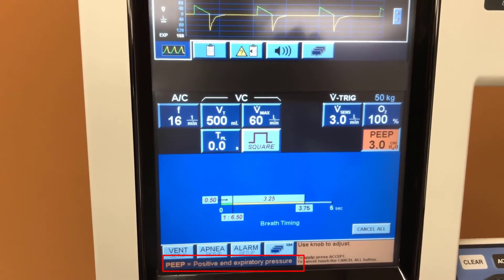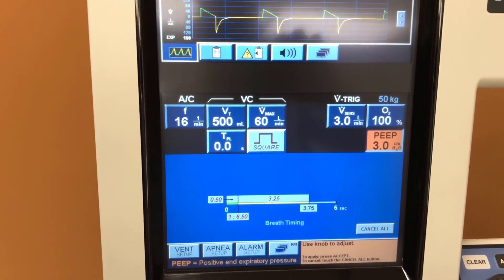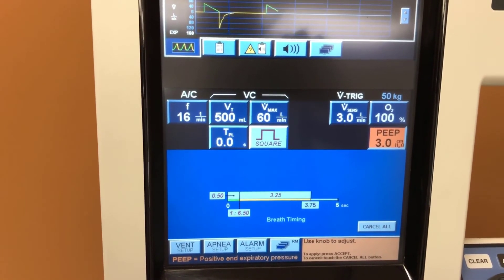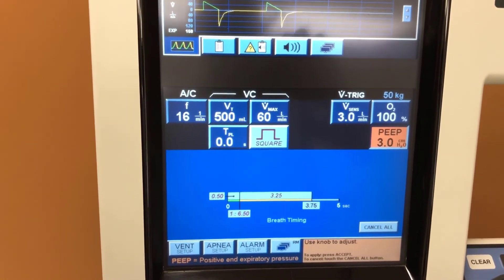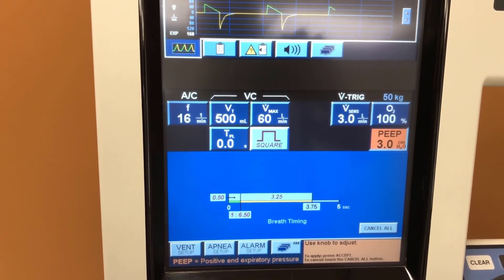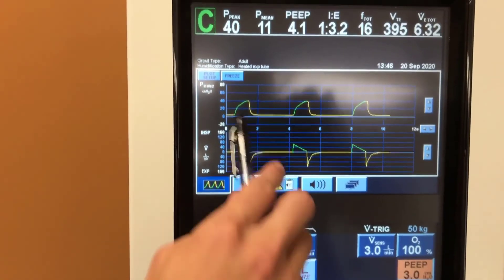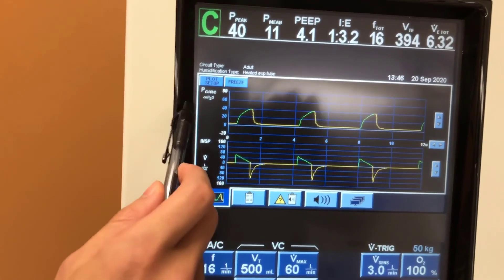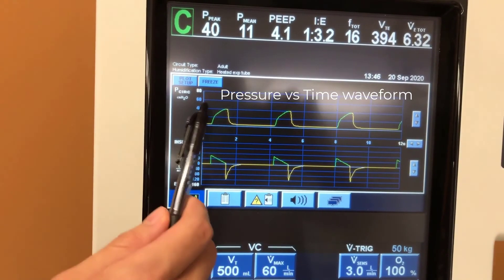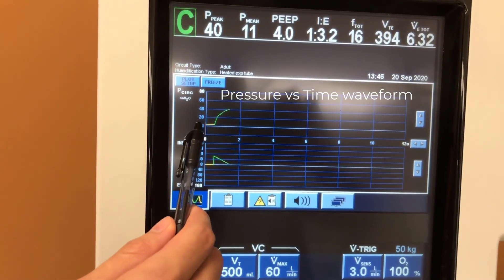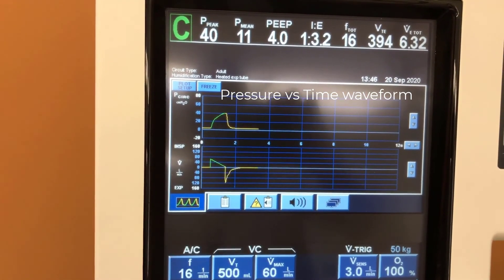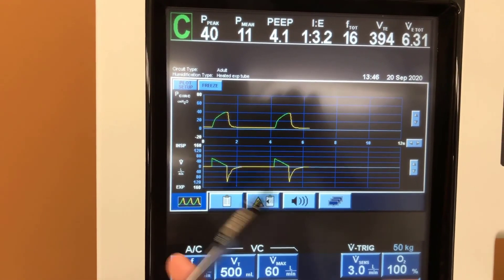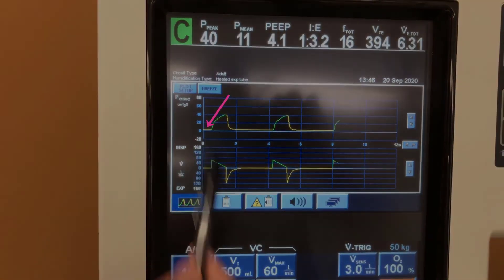This means that three centimeters of water of pressure is being delivered into the alveoli to keep them from collapsing. This can be seen in the graph of pressure versus time in these yellow horizontal lines — as you can see it's at about three, which is our PEEP number, and it never reaches zero.